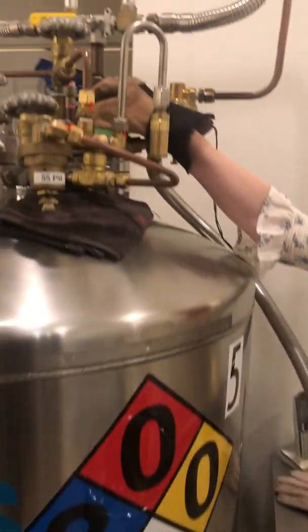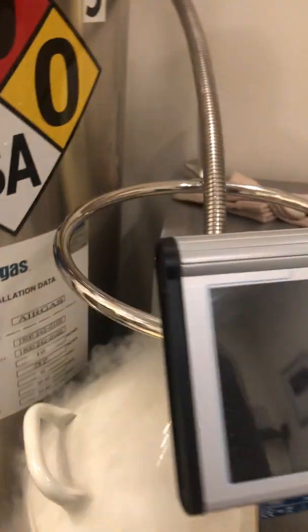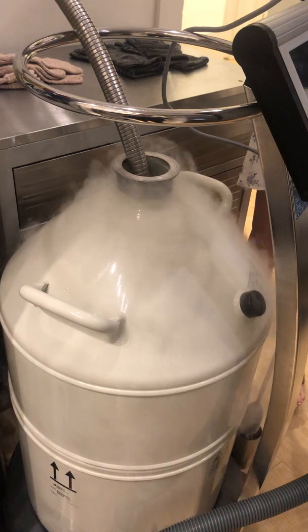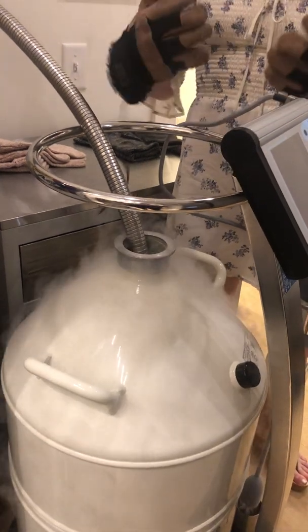And then I'm going to turn the nitrogen on very, very slowly. So as you can see, just the pressure of the liquid nitrogen entering the dewar is causing some of it to spill out. So you just want to take turning up the liquid nitrogen pressure very slowly.